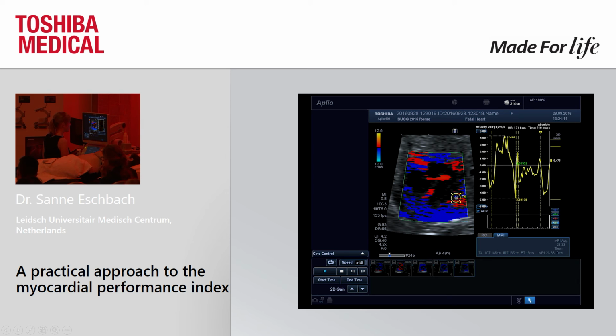If you go on the left side, in this fetus it will be very difficult. But we can try. Here you see the image changing a lot, probably because it's just too difficult to obtain here. Any questions about this, or maybe people would like to join and try it? You're invited to try it yourself and see how it works.